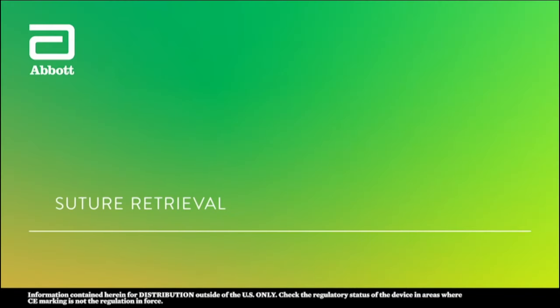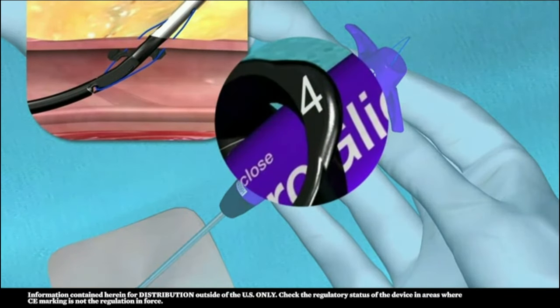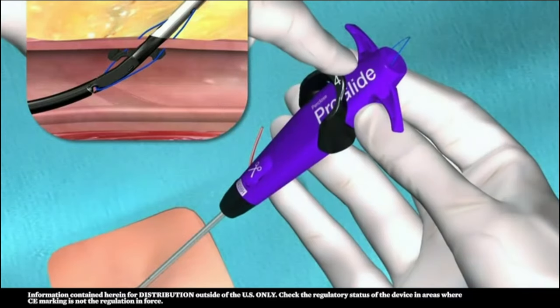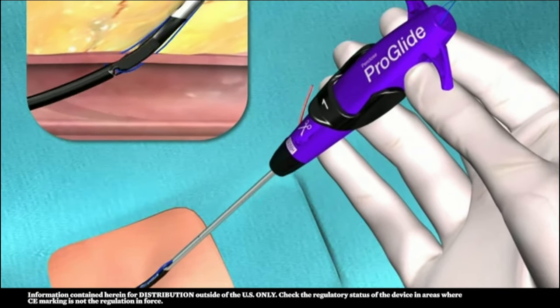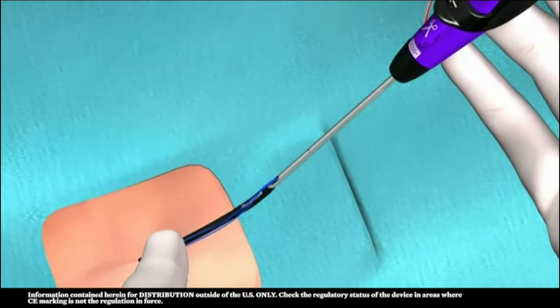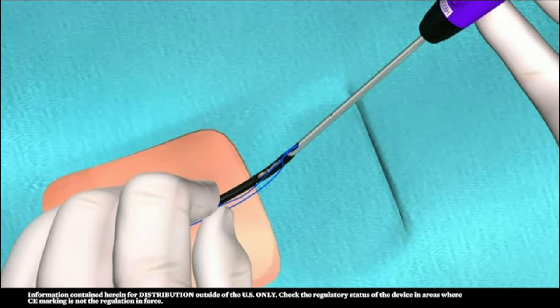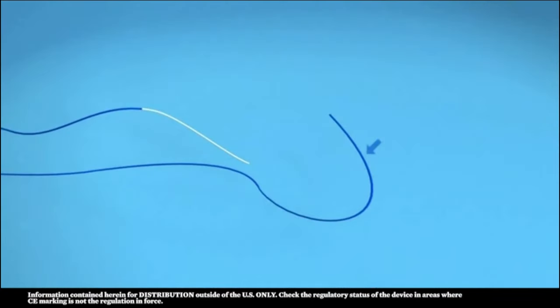Suture retrieval. Relax the device and then return the foot to its original position by pushing the lever marked number 4 on the top of the device down to its original position. Withdraw the device until the guide wire port exits the skin line. Grasp the suture adjacent to the sheath and pull the suture ends through the distal end of the proximal guide. The rail suture limb is blue and longer, and is the suture limb that will be used to advance the knot. The non-rail suture limb is white and shorter and will be used to tighten the knot.